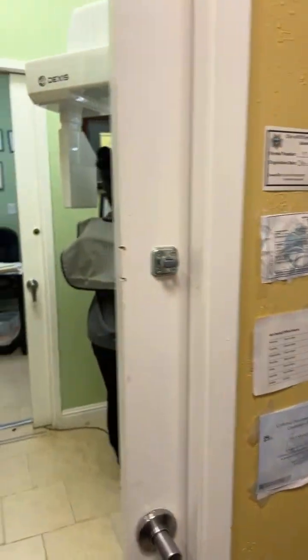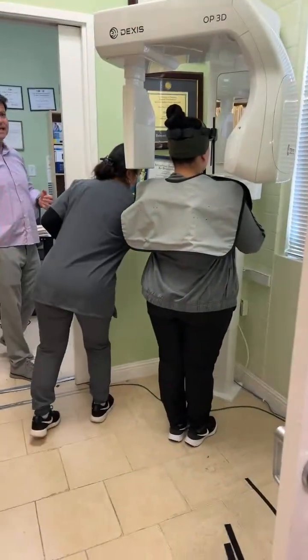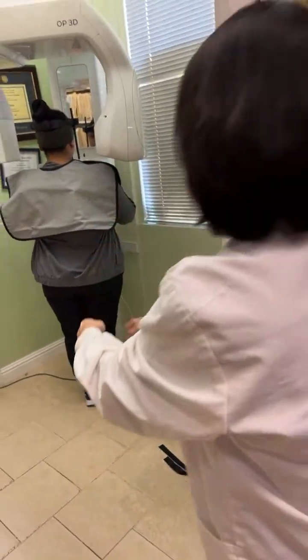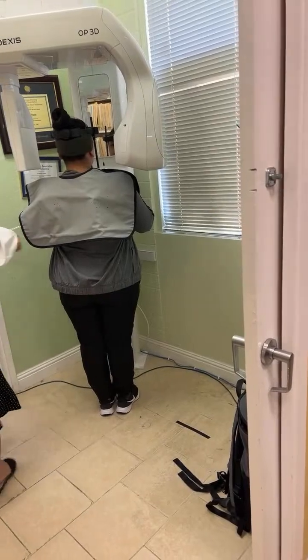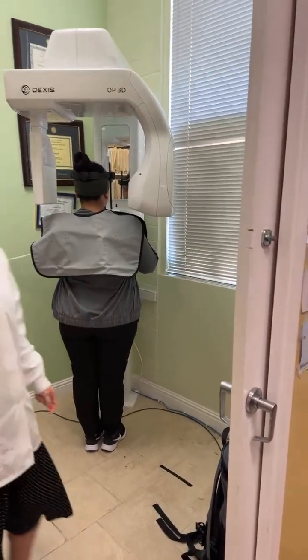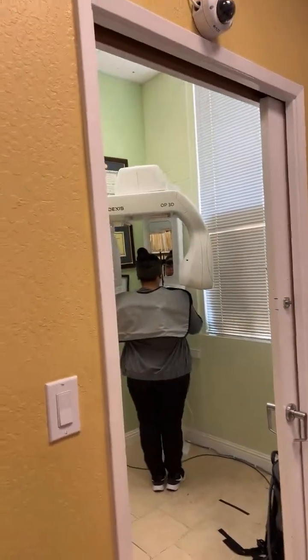The real deal. So now you have the confidence that you're not going to miss anything. Now take it. And it's very fast. When you guys get this down, why don't we just go this way? I think you go this way. It's better for you. Hit the patient before it, but this is fine right here. Okay. This is going to be a longer exposure. It'll look good.